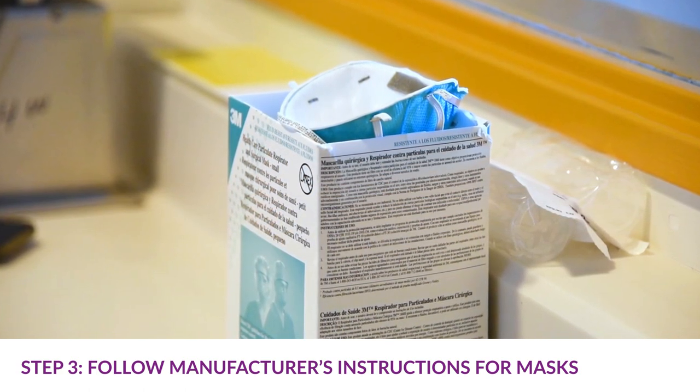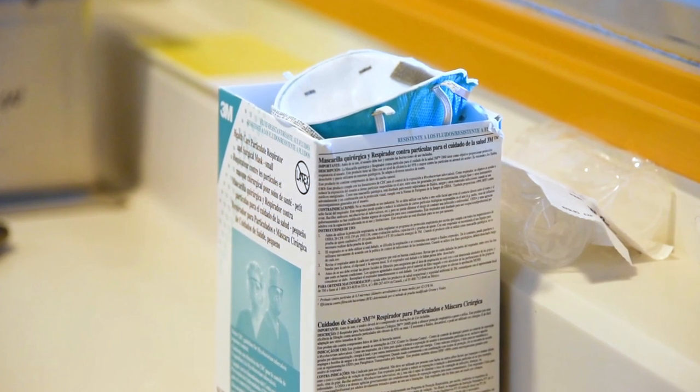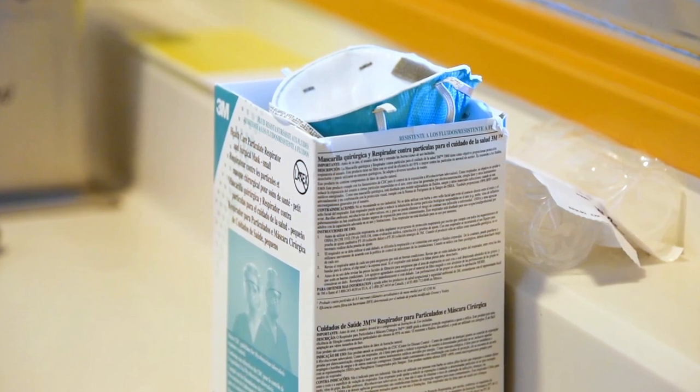Mask selection is an important step when donning PPE. For droplet contact precautions, a surgical mask with a shield is an appropriate choice. In this example, the N95 was selected for airborne precautions due to the aerosol-generating medical procedure being performed.